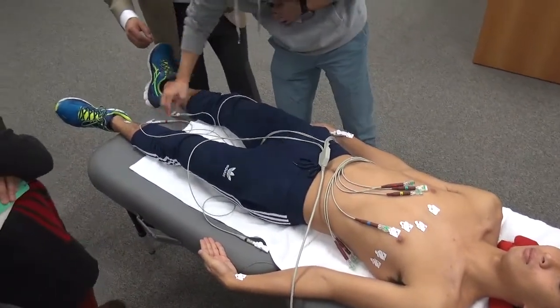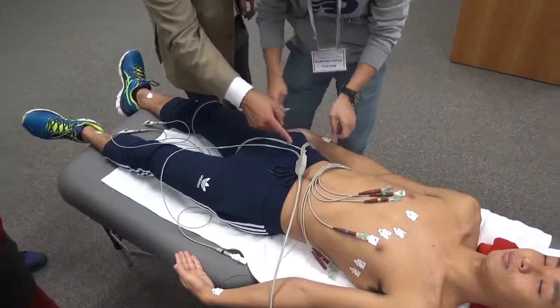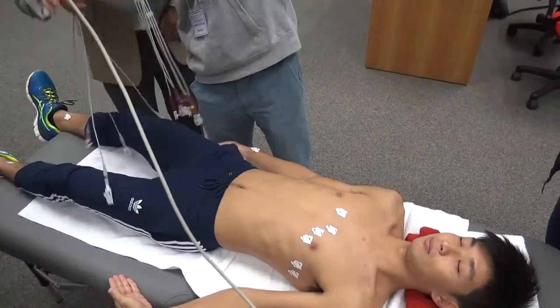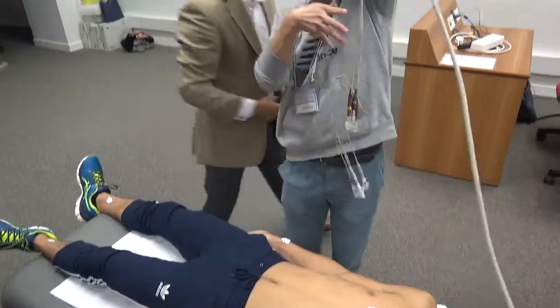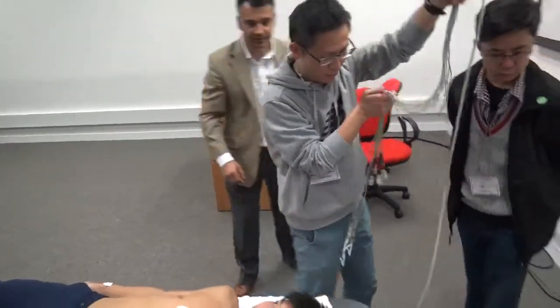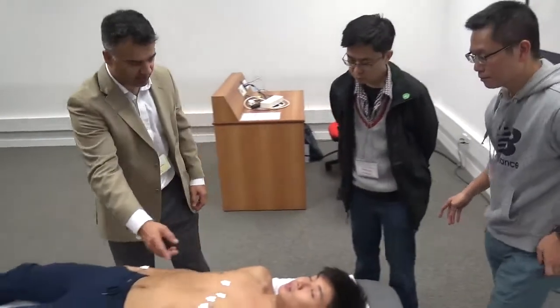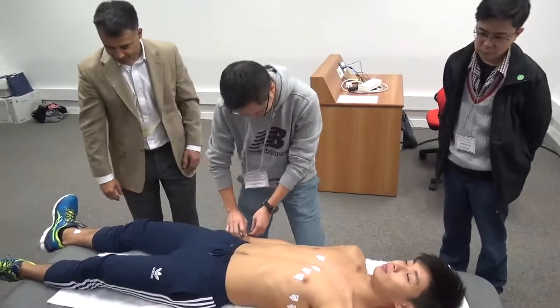Okay. And then you just grab this one and lift it straight up in the air. That's it. Grab the whole thing together, like that, and then just lay it over the ECG. Again, another 5 minutes. This is important. I know it sounds obvious, but it's so important, otherwise it will just get knotted. Okay, and then take your leads off and then you're finished.